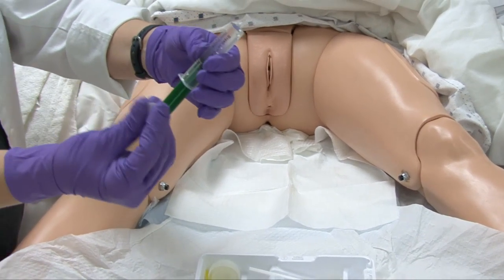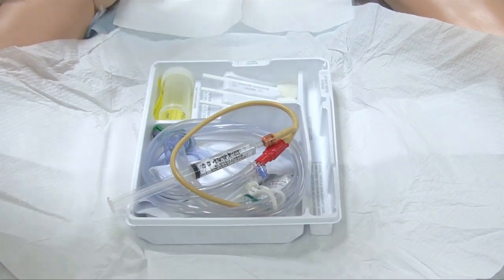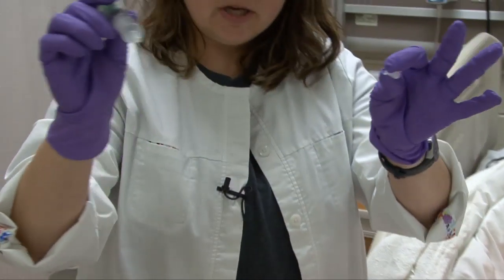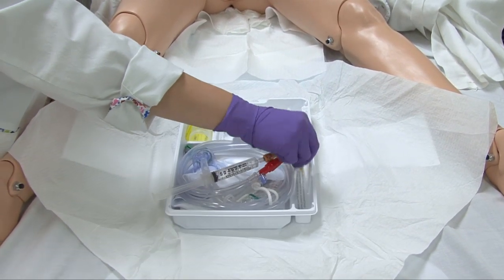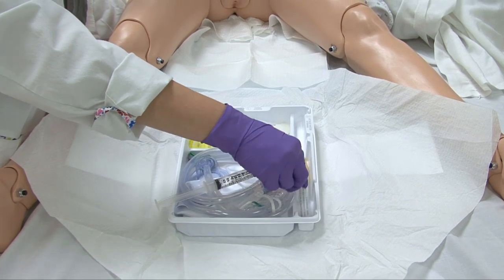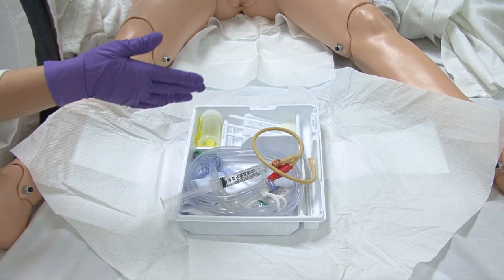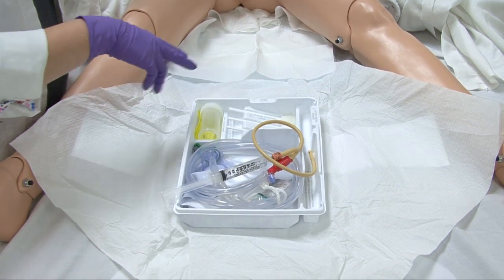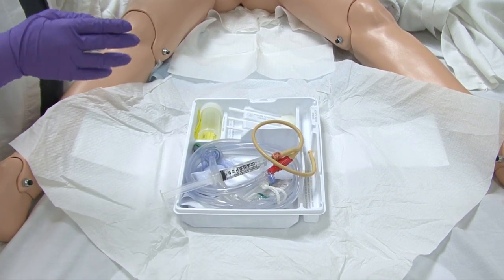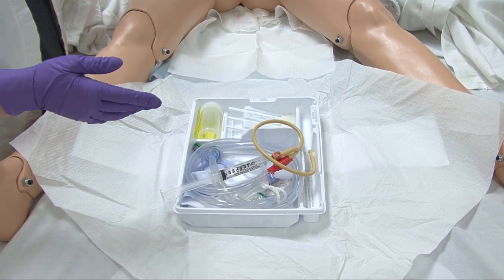I'm going to come over to the actual Foley catheter — it's already attached to the drainage bag; always ensure that is true. Here's the balloon port, it says inflate with 10 milliliters, confirming it is a 16 French catheter. Attach the sterile water to the balloon port and take the plastic off the catheter while controlling the catheter so it doesn't fall and get contaminated. Drop the blue wrapper into the trash without contaminating or going below the waist. Step four: squirt the lubricating gel into the tray, lubricate about two to three inches of the catheter, and leave the catheter in the gel to maintain lubrication.